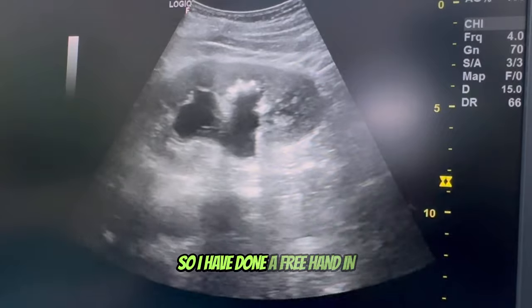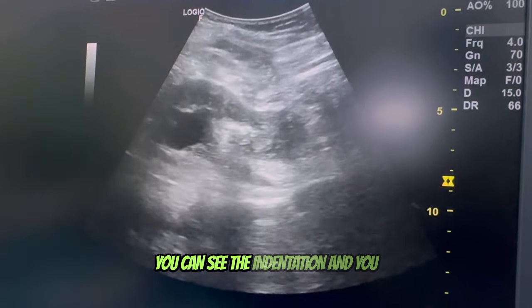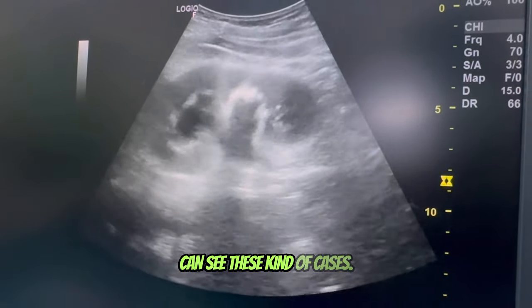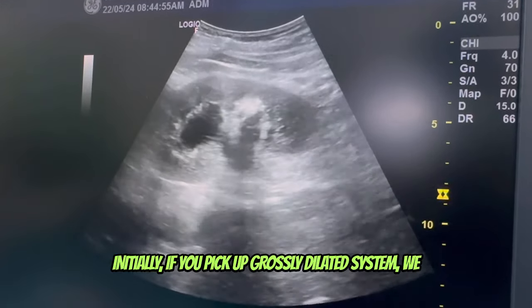I have done a freehand inline puncture and targeted the middle calix — you can see the indentation. In these kind of cases, if you initially pick up a vastly dilated system, you will gain confidence to do an ultrasound-guided puncture.